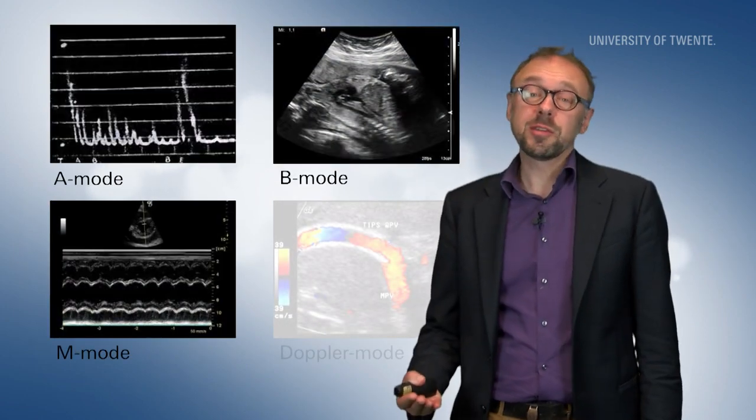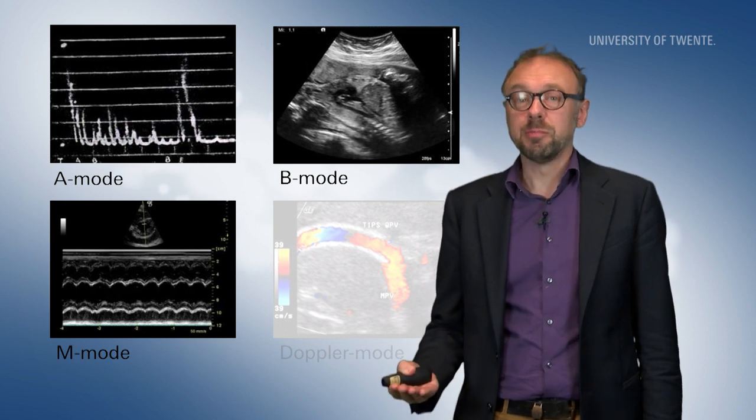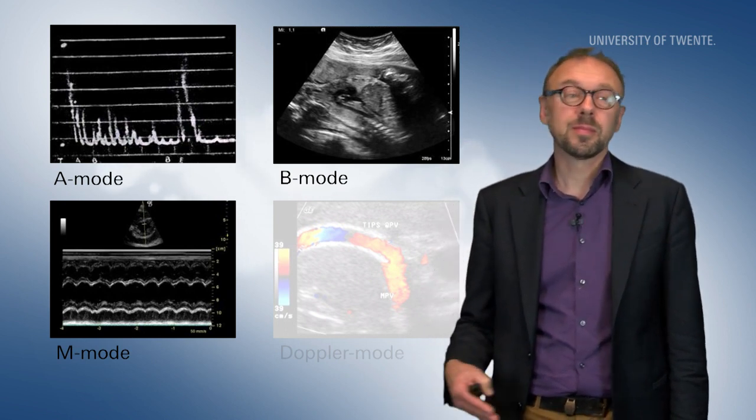So there is a rich variety of visualizing ultrasound data, of which the B mode is the most important one. These many modes will allow you to get as much information as possible out of your ultrasound scan.